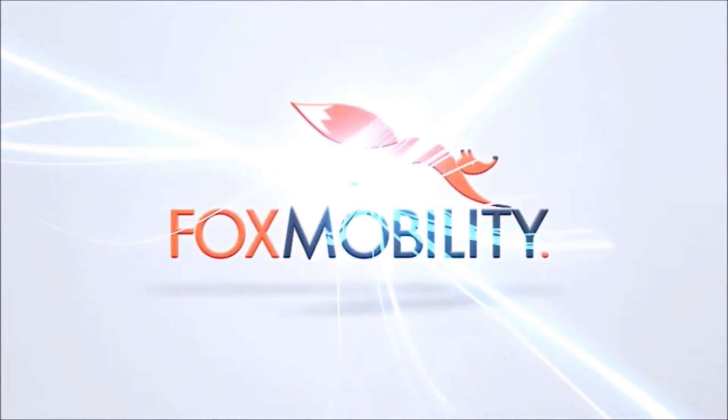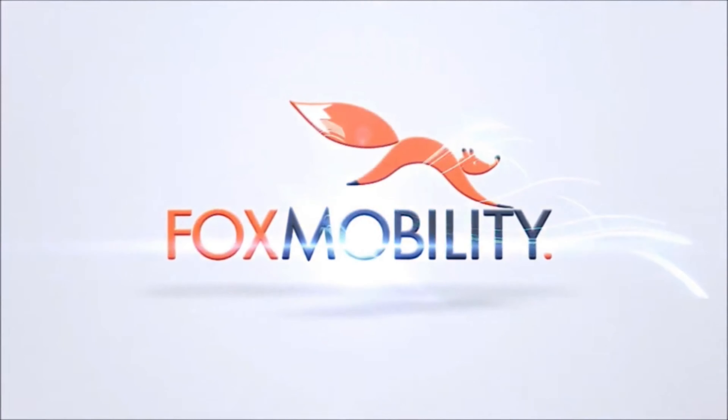Welcome to the eFoldie instruction video. Over the next few minutes we will show you how the eFoldie works. While operating, please watch your hands carefully and never place your hands close to areas not shown in this instruction video, especially areas of moving parts which may cause injuries.